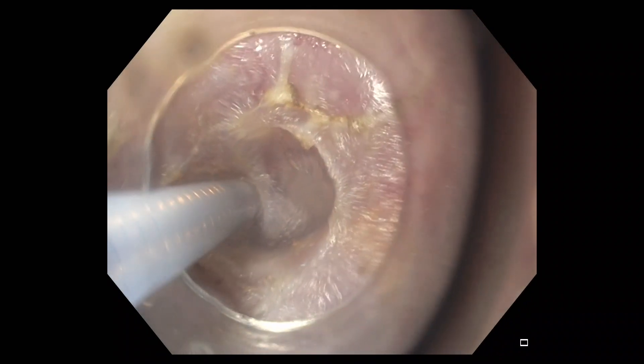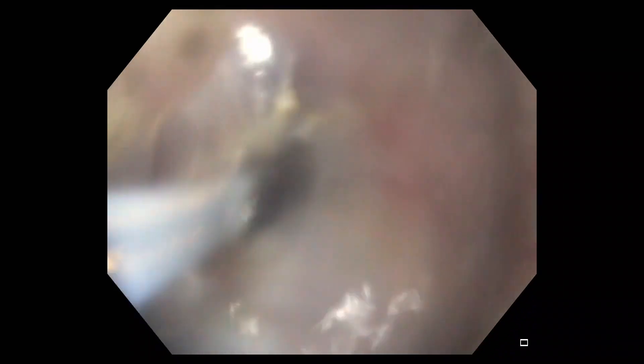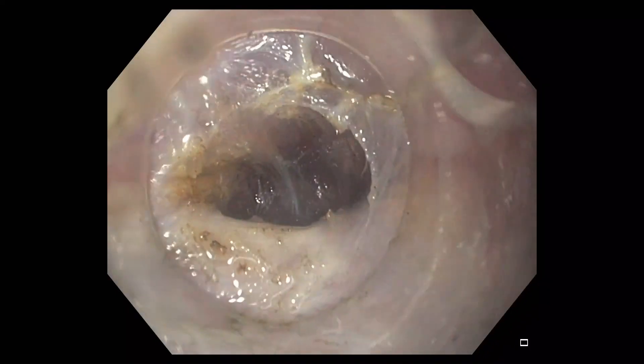Again, the integrated water jet function is used to expand the submucosa adjacent to the duodenal wall behind the pylorus. Expanding this space will provide a safety margin during subsequent pyloromyotomy.